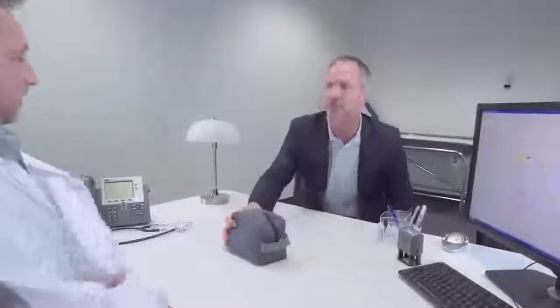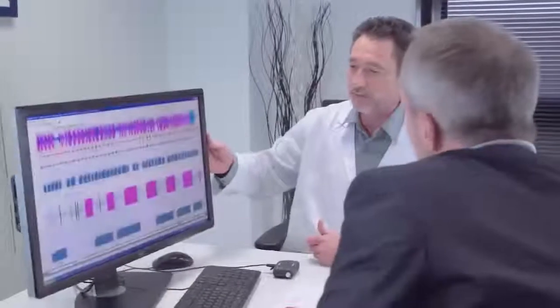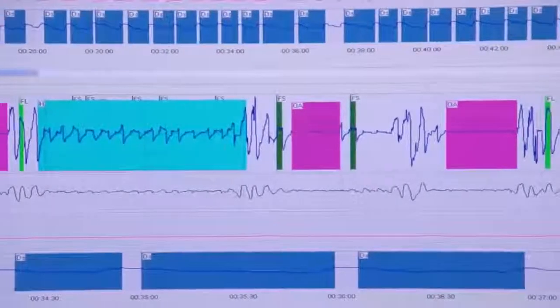The ApneaLink Air has now recorded a wealth of data about your sleep patterns. This data is downloaded and analyzed on your clinician's computer. Your clinician will be able to assess whether or not you are suffering from sleep disordered breathing. Rest assured, there are simple therapies that can be offered to treat these conditions and relieve you of the debilitating symptoms. Your clinician will happily tell you more on your options.